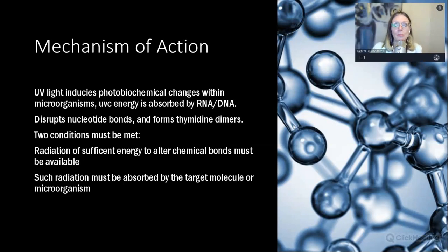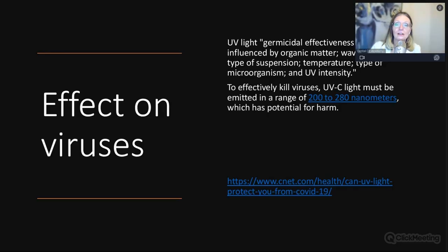Now, we know there are technologies that are being used, not here in the US because they're not FDA approved, but you can actually use a dye to help with that targeting and light therapy. Photodynamic therapy is one of those, PDT, which is used in Europe and I believe South America, but not FDA approved here. So changing the target molecule some way so it's more receptive to the UV light.